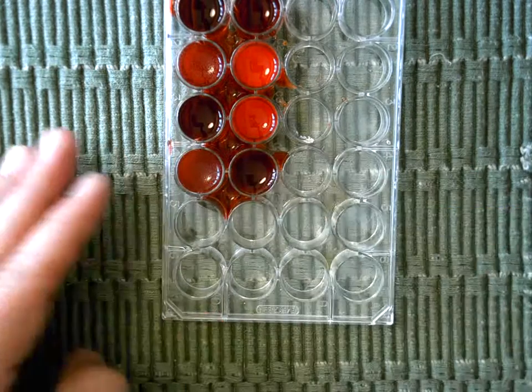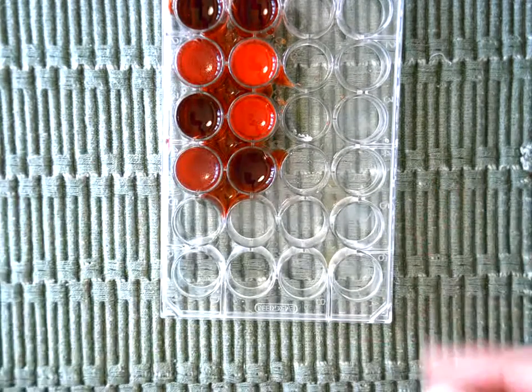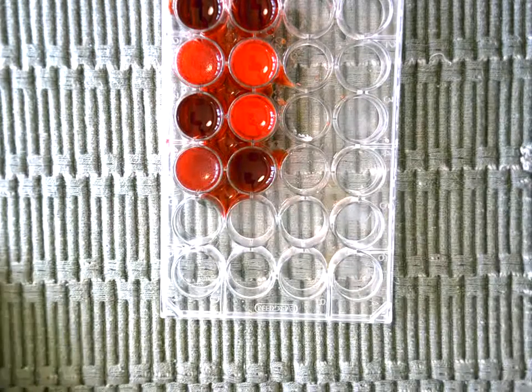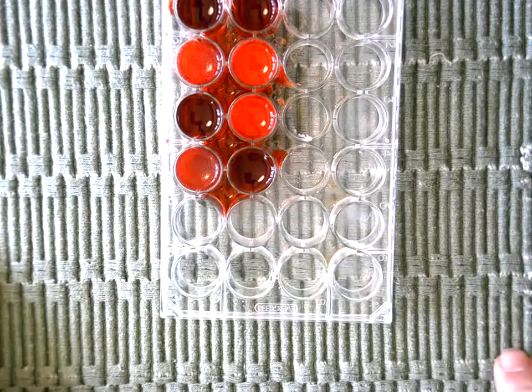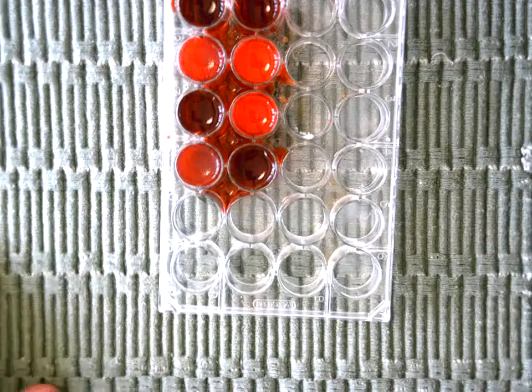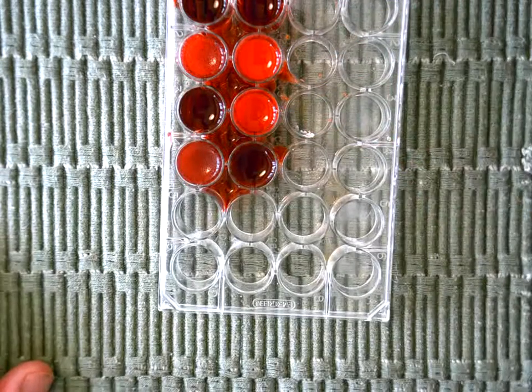Now if we remember from the lesson, someone's blood will clump if they have the antigen or the protein and the antibody. Now I'd like you to try and diagnose the blood types of these four patients using this data.